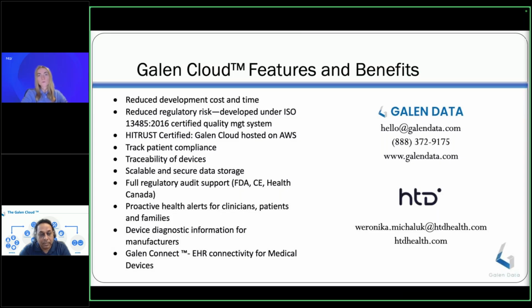So my recommendation would be to always start with a regulatory consultant or your regulatory team and talk about your intended use. If you don't have an intended use drafted, chat with the consultant or the expert, and you will draft it together. Sometimes it might be beneficial for you to be software as a medical device from the reimbursement aspects, because sometimes there are new reimbursement regulations for new innovative solutions and for medical devices. So maybe it would be good for you to be considered a medical device.